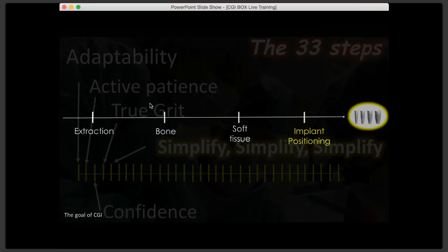Implant aesthetics is affected by positioning, no doubt about it. But the only goal, the pure goal of guided surgery is to place the implant in the right position, which is huge. A lot of doctors are not placing implants because they can't get them right, can't get them at the right angle. They're all crooked or too buccal, too lingual, too apical, too coronal.